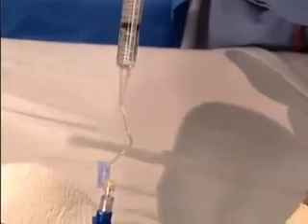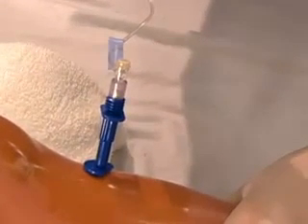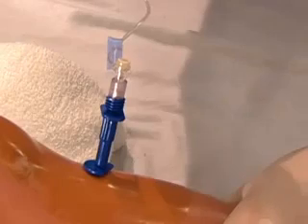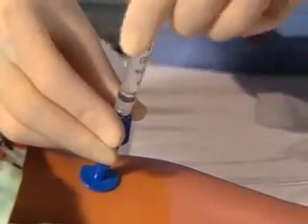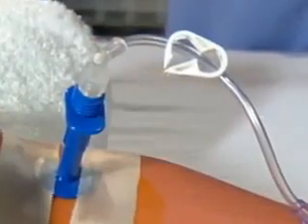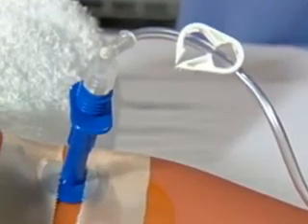It is normal to sense resistance during the manual infusion into the intraosseous cannula, as the bone marrow cavity is not distensible. A syringe can be attached directly to the needle hub. Alternatively, attach extension tubing to the needle hub to avoid further needle movement. Use wide-bore tubing when available.